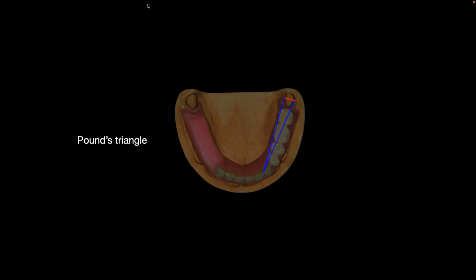That's how we set up teeth. So that's an important guideline for the buccolingual position of the posterior teeth, which is again dictated by the retromolar pad. What about the occlusion?